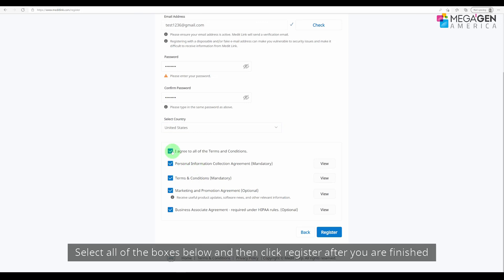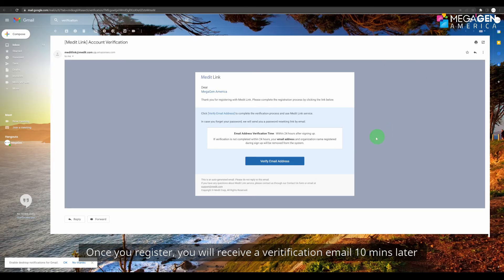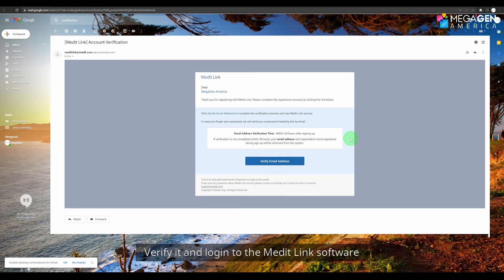Click 'Register' after you are finished. Once you register, you will receive a verification email. Verify it and log in to submit it to Medit Link software.